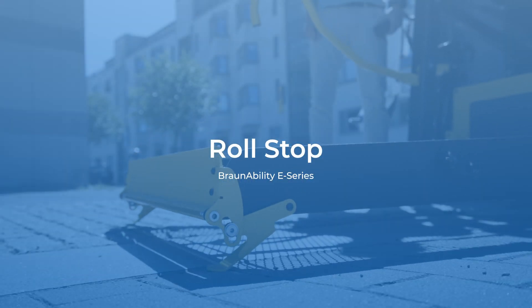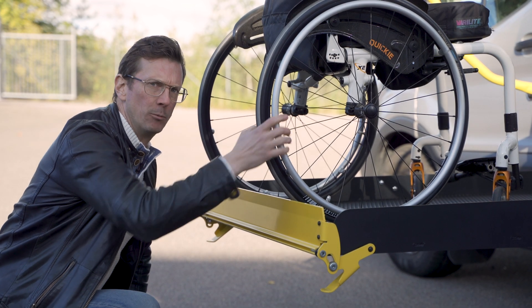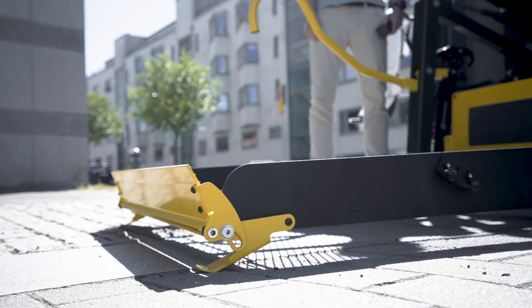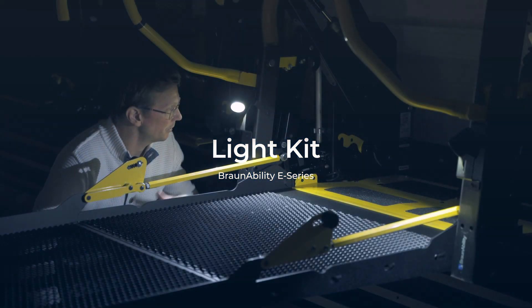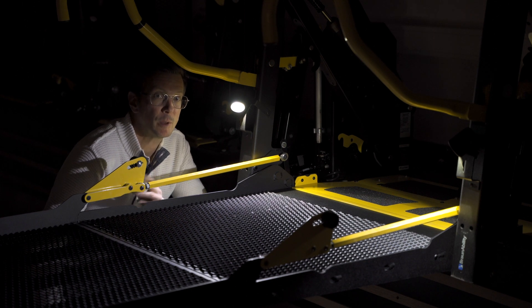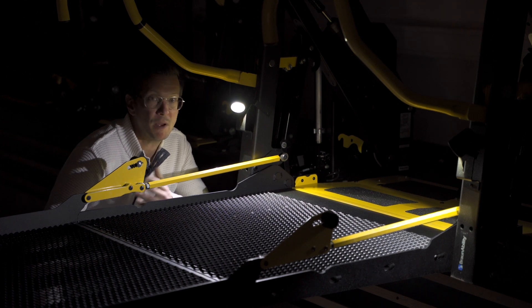A roll stop is an important safety feature — it prevents any wheelchair from accidentally rolling off the platform. The E-Series roll stop is mechanical and goes up as soon as the platform leaves the ground. When using the E-Series in low light situations, our optional light kit provides platform illumination and overall improved visibility for the user, the operator or anyone passing by.